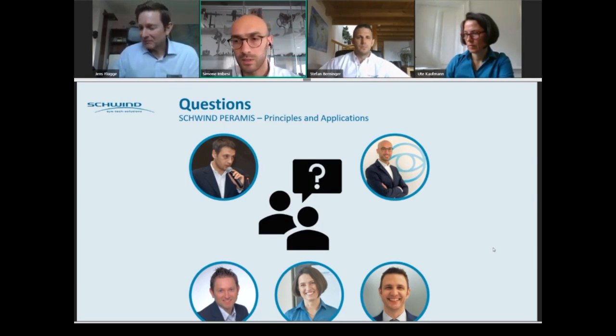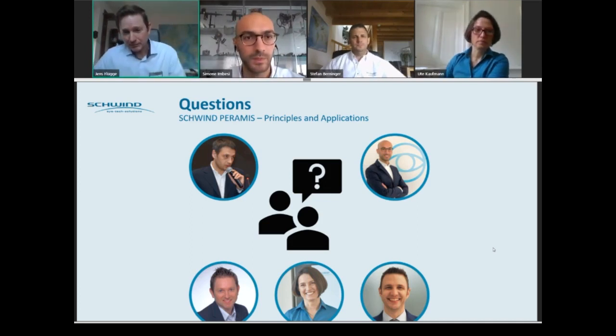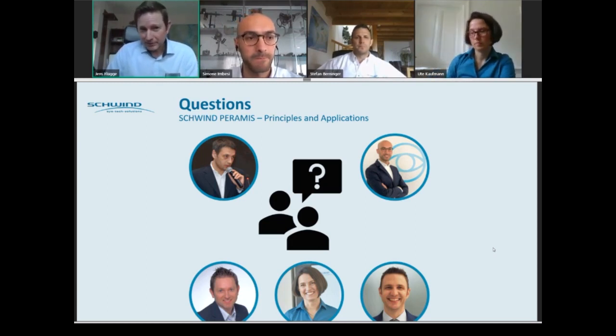All right. Perfect. And regarding dry eyes, what about artificial tears? What would be your recommendation prior to a measurement? Because I personally always, when I go out from the application part, I tend not to use artificial tears if it's not necessary, of course, but sometimes if you have really dry eyes, it might be necessary. So what is your opinion?